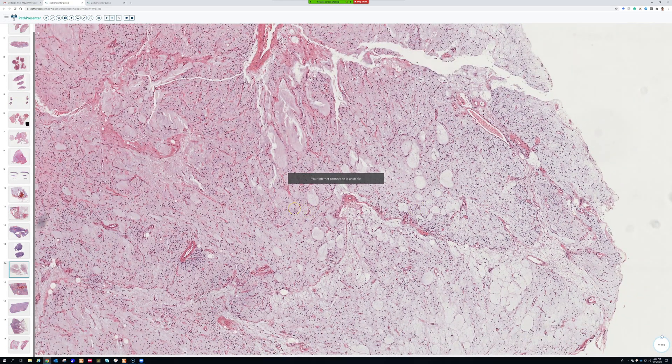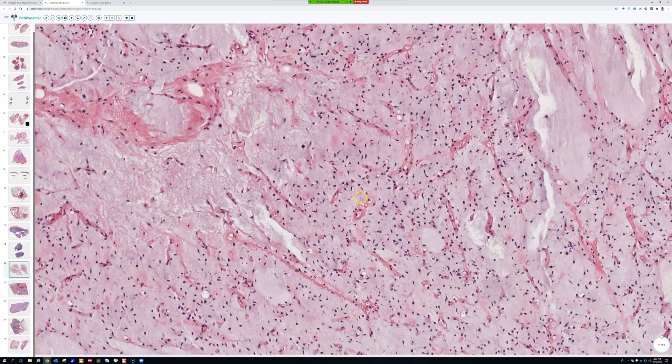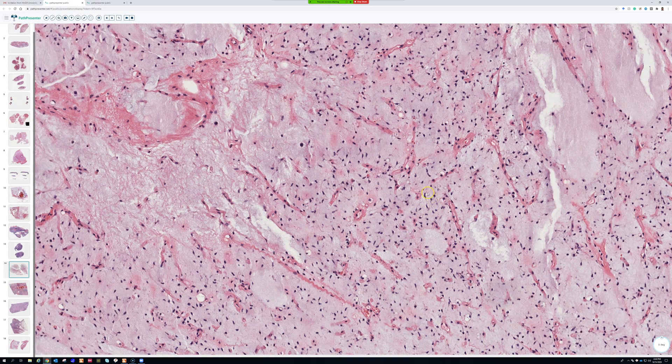One thing that is really helpful in telling it apart from a lot of other myxoid tumors is that the cells are spread apart and do not touch each other — they respect social distancing. They have a very large personal space bubble, and they're good social distancers. They stay away from their neighbors and very few of them overlap.